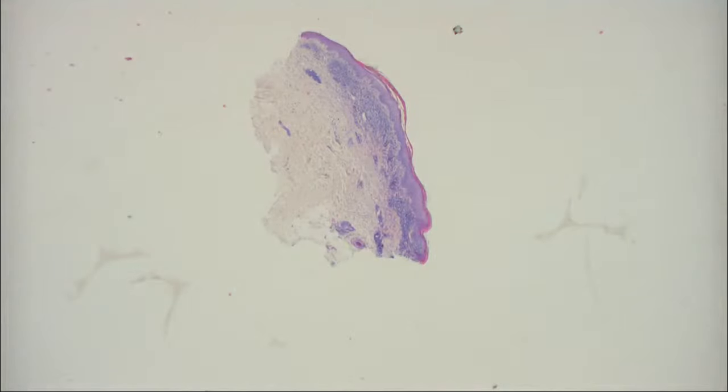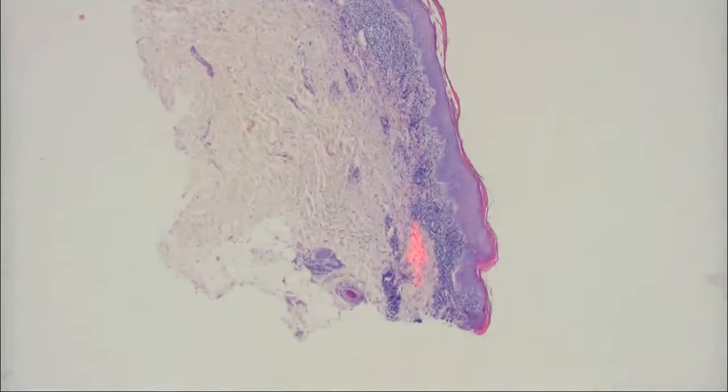All right, this is another punch. Good. And the striking finding on lower power is the lichenoid infiltrate. Now, is it really truly lichenoid? See, people kind of say that, but it's not really lichenoid, is it? Because it's not really obscuring the dermoepidermal junction. It's more kind of band-like.